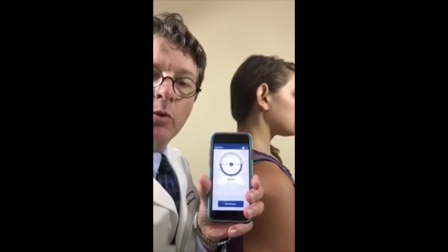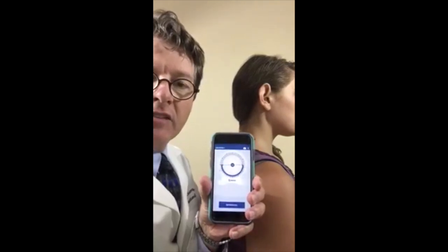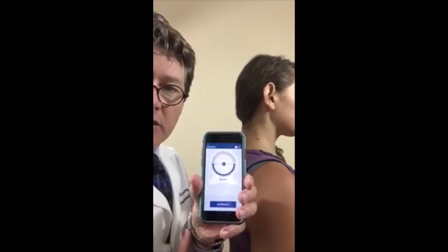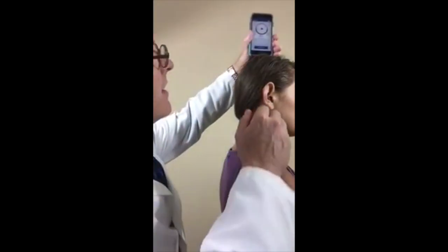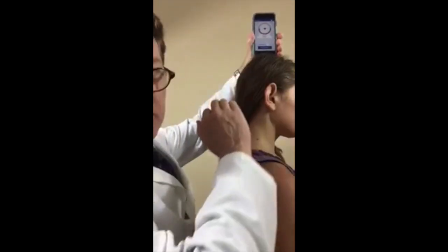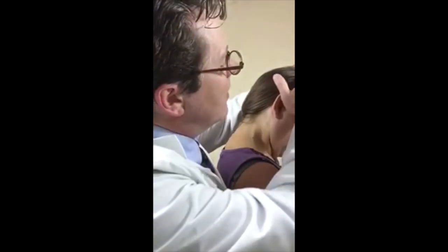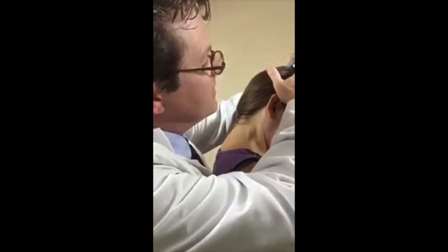Now we're here with the patient. We're going to see the Ratefast dual inclinometer in action. As noted before, we have the inclinometer set to location one and it's asking us to set reference. Here with our patient model, I'm going to go ahead and put the device on the top of her head as location one. I set reference and ask her now to go ahead and flex her head forward as far as possible. She is now in full flexion in what we call the sagittal plane.